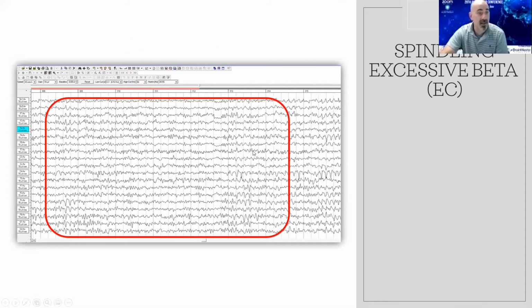Spindling excess beta. I mean, again, I hope I didn't really need the box, but for the sake of consistency, I used one in the presentation. But you can see here, this 1, 2, 3, 4, 5, we're at about 20 hertz. You can see here that it really persists through this whole, here's some slow activity, but then we've got a burst of beta, and then it speeds up, and we've got some beta spindling. We have it over here, over here. I mean, it's really everywhere throughout this recording.